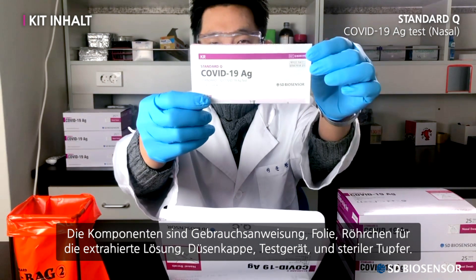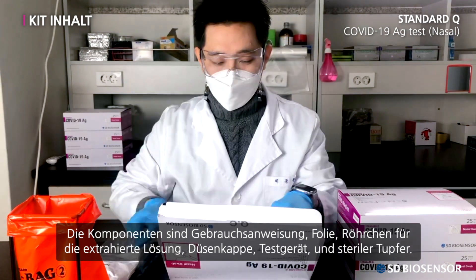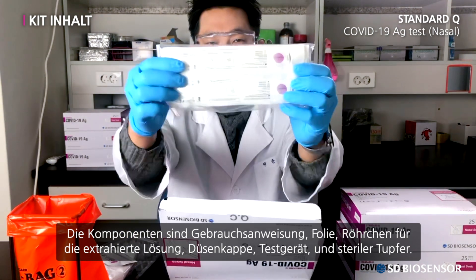The components are: the instructions for use, film, extraction buffer tube, nozzle cap, test device, and sterile swab.